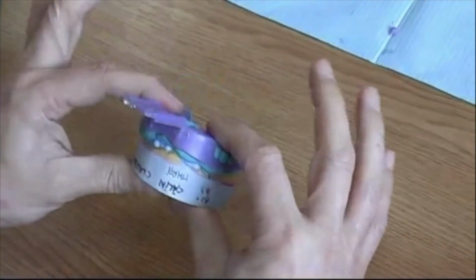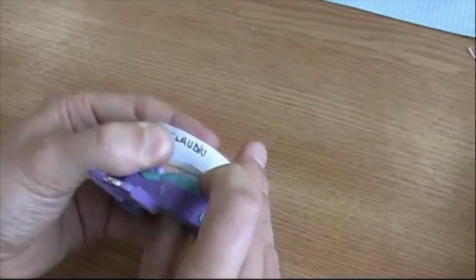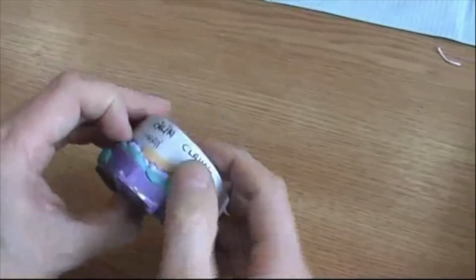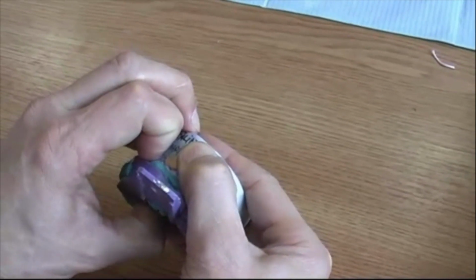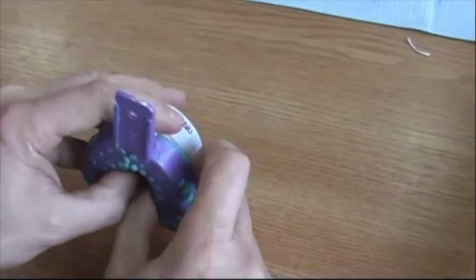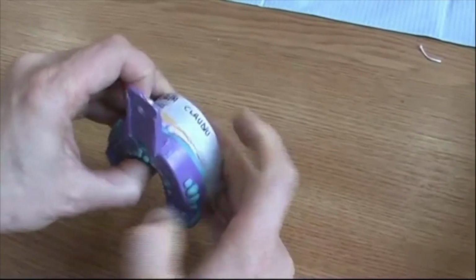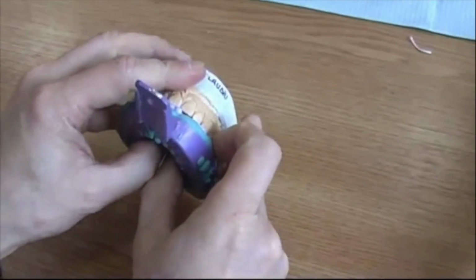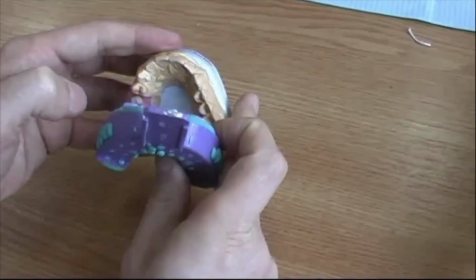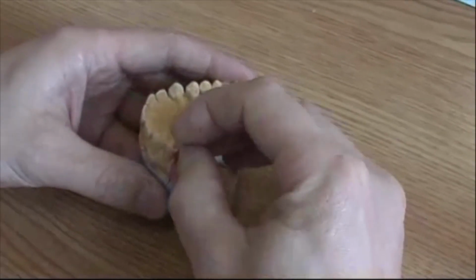Of course, in the mouth we keep the tray on the mouth of the patient, on the teeth. We keep it with the finger. And then we have to remove it again from the premolar region. Maybe you could blow air there, or the assistant can blow air under the impression and in between the impression and the gum. And then it simply pops up like this. And that's the preparation, you see.